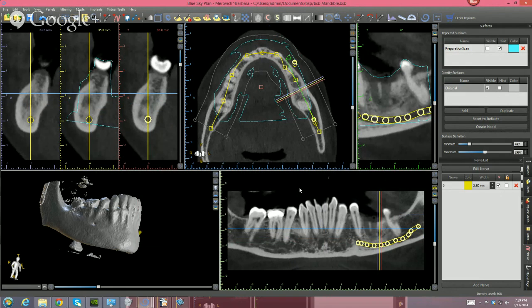Anyway, so that's another one of the problems here. Dr. Gross is mentioning that even that doesn't. Sometimes what happens is, because I think I mentioned that you can deflect the implant towards the buccal when you're putting an implant into the osteotomy, even with an undersized drill diameter, it gets pushed back by the cortical bone. I think I mentioned that.